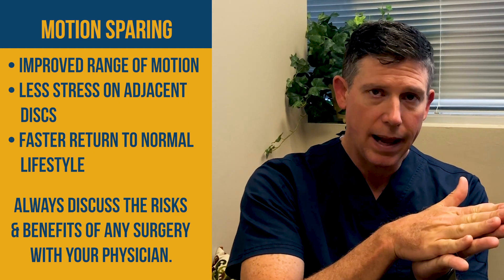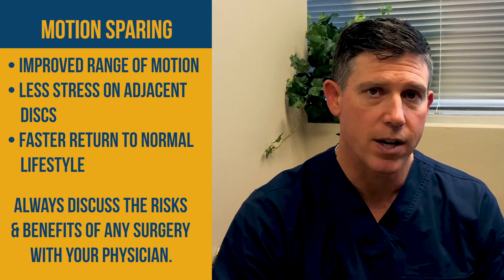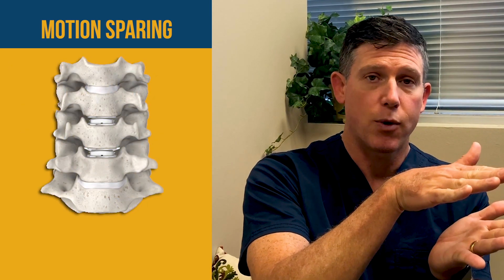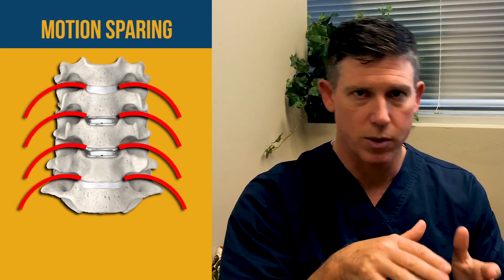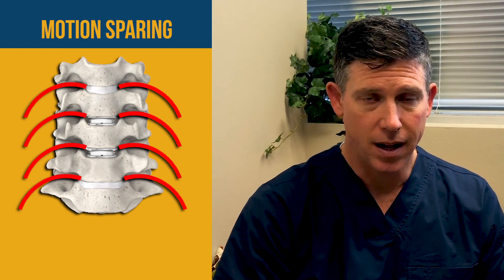If that disc space collapses, there's not as much space for the nerve, and it doesn't really matter what you do. One of the advantages of this disc replacement surgery is that we spread the vertebrae back out, creating a taller foramen for the nerve to exit — in addition to evacuating the disc, which was poking into that space and interfering with the nerve as it was trying to exit the spine. You can do two levels with this particular disc replacement procedure, and according to Dr. Jones, you can be very active even after the surgery.